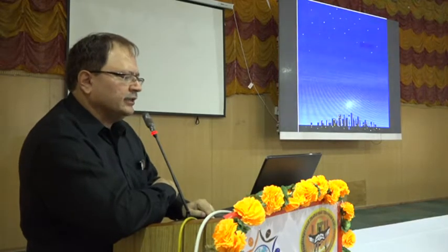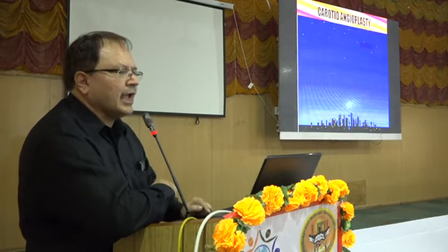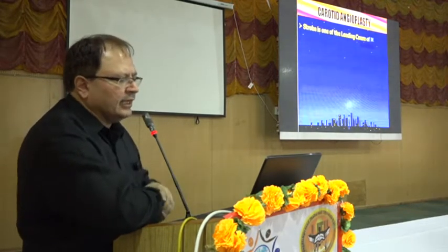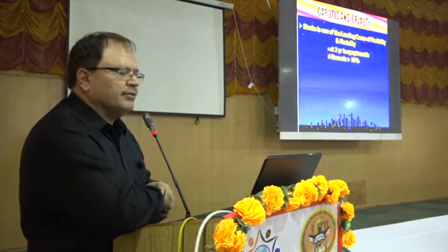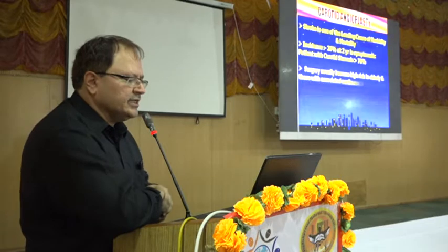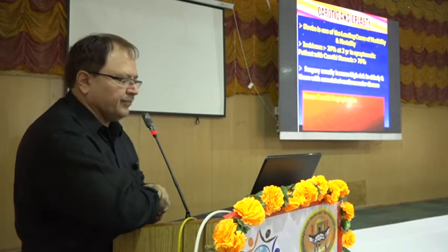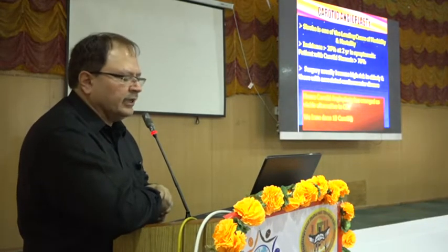The most important now is carotid angioplasty. Carotid angioplasty is very, very important, and we have developed new equipment for the angioplasty, which has made it very, very safe. As you know, stroke is one of the leading causes of morbidity and mortality. The incidence is 26%. The indication is if the patient is symptomatic and the lesion is more than 70%. Surgeries usually become high risk in the elderly and those who have associated cardiovascular diseases. Hence, carotid angioplasty has emerged as a viable alternative to carotid endarterectomy.